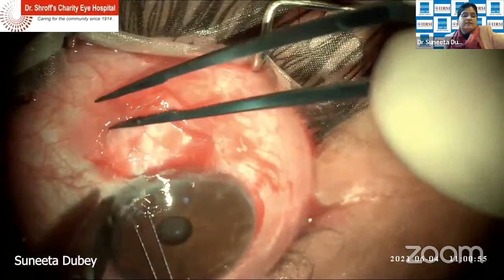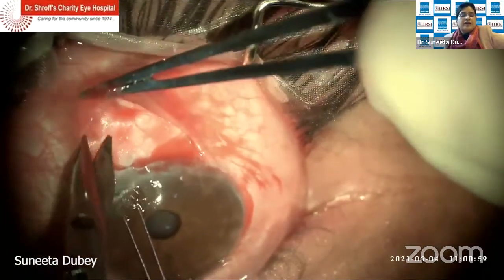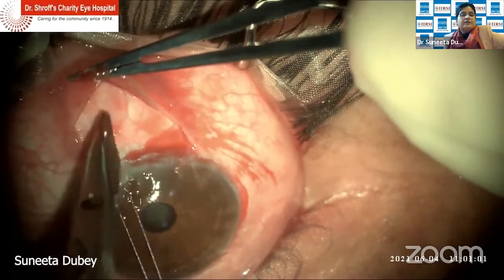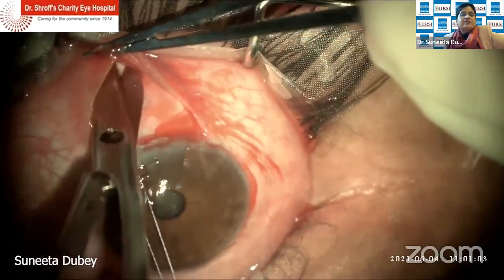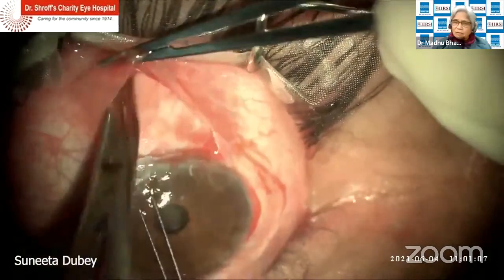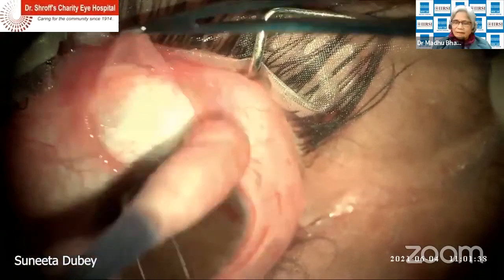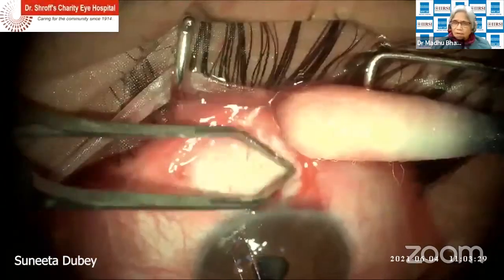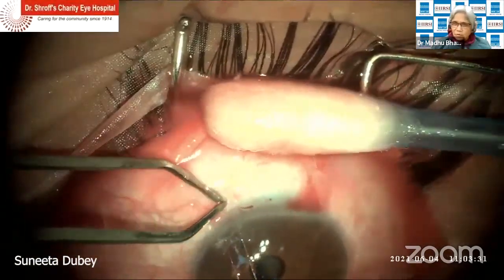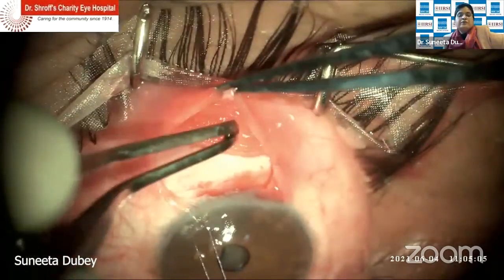So here, we are giving a relaxing incision, but sometimes I don't give it. And actually, the relaxing incision is to be given in Tenon's, not in the conjunctiva. A relaxing incision in Tenon's is always good. Yeah, Tenon's, it gives you bigger exposure. In the conjunctiva, relaxing makes the closure of the conjunctiva not so good looking. So now coming to this mitomycin C.